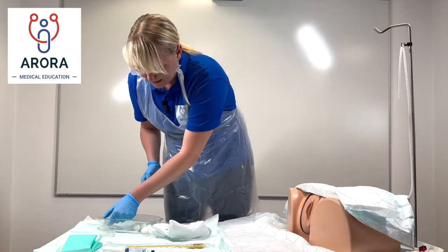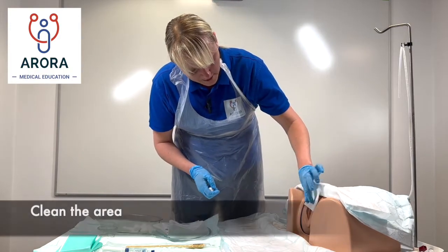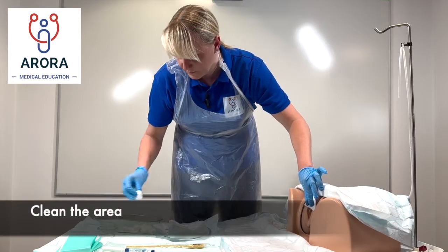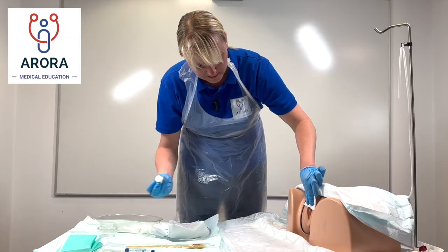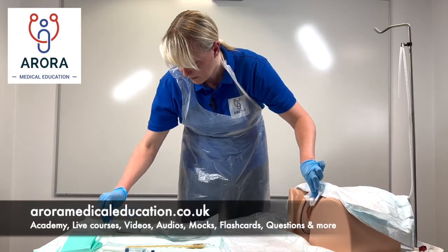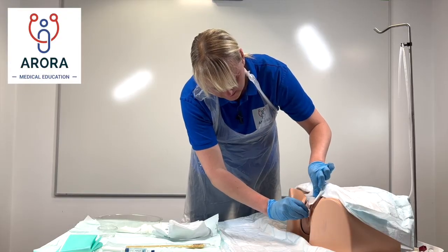Explain to the patient: 'I'm just going to clean the area now with some water — it might feel a bit cool, let me know if it's uncomfortable at all.' Here we're just going to gently part the labia with a piece of gauze and use single pieces of cotton wool in water, cleaning the area with single downward strokes until the area is clean.